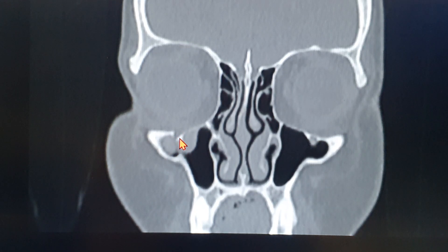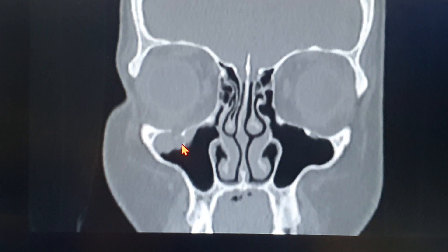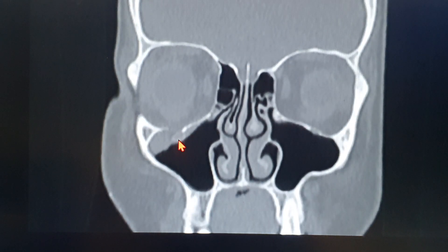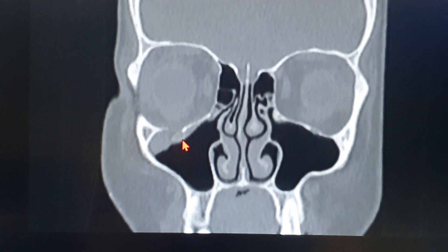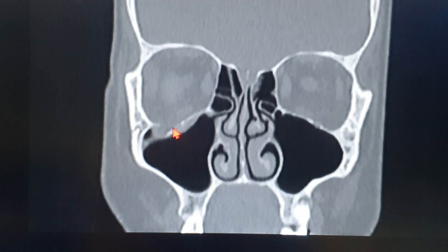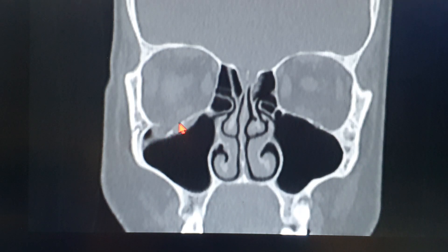You cannot be fully certain because you cannot clearly see the prominence of the nerve body. But as I go further back, you can actually see a foramen or canal-type structure — the infraorbital nerve canal — here as well. There's a small opacification; that's the nerve right there. This is essentially the entire plate of the orbital floor through which the infraorbital nerve runs via a canal. You can actually see that this entire plate has fractured and dislocated below at an oblique slant.